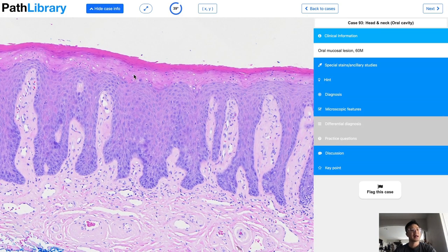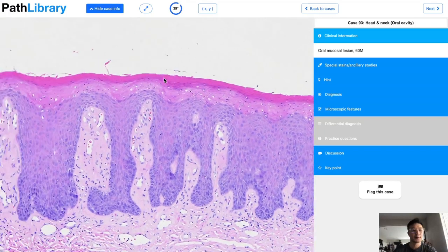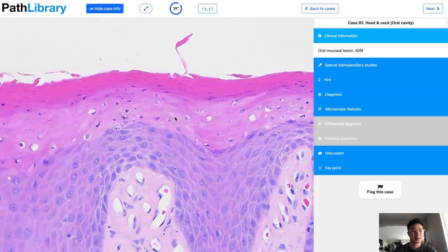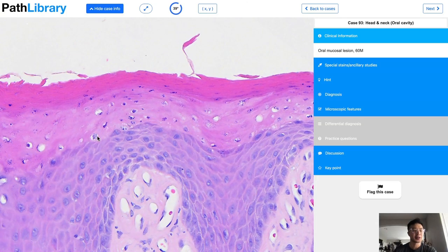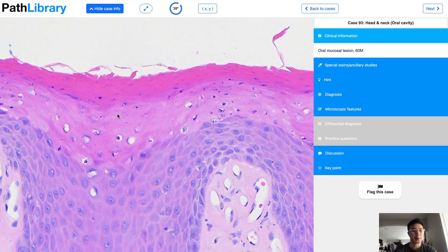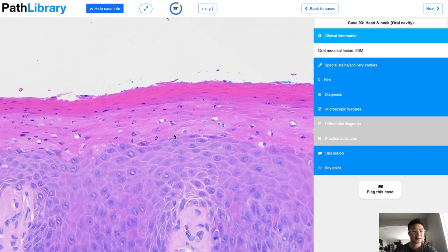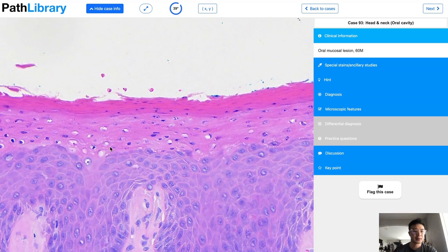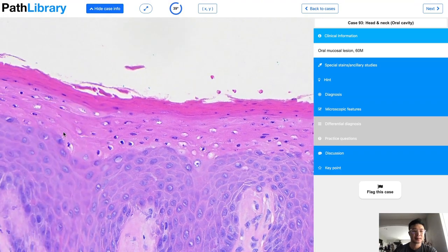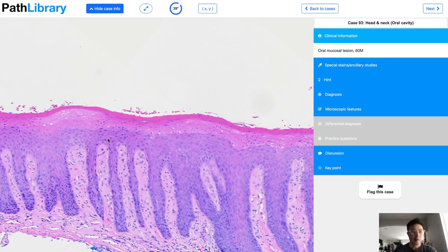And then in the top part of the epithelium, including the stratum corneum, you see dead cells, or cells that are undergoing death with apoptosis, karyorrhexis, pyknosis, but you have cells that have naked nuclei. And it's a sharp transition from the top third to the remaining area of the epidermis.